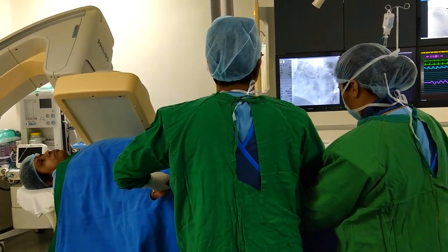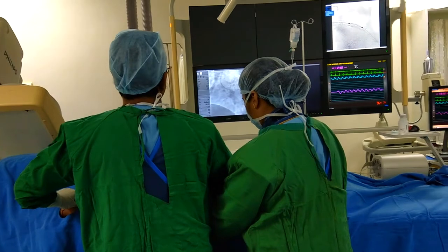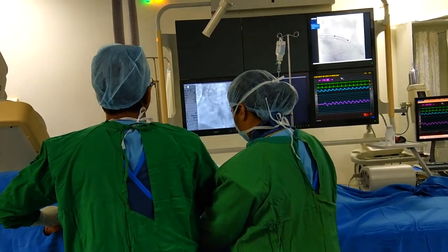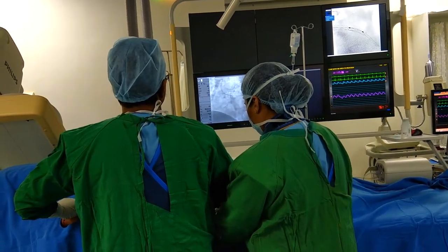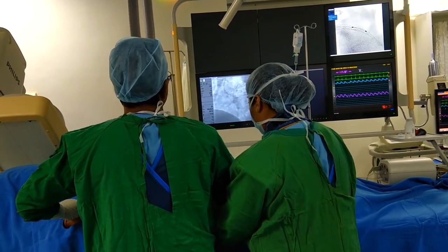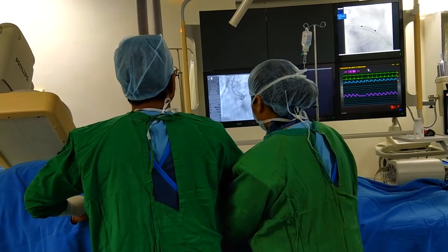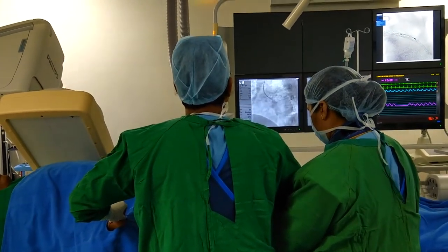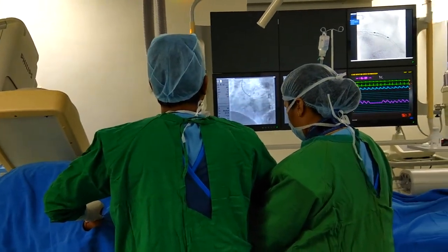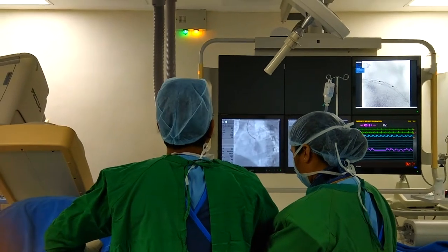Based on the intravascular ultrasound result, sometimes ambiguous lesions — in cases of calcium-rich or calcium-filled blockages, severe angulation, and tortuous vessels — can be visualized very clearly by the intravascular ultrasound device.